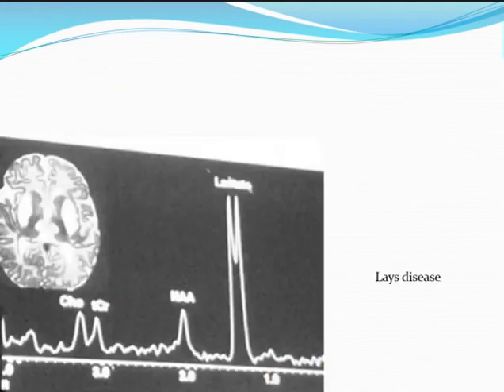This image was adopted from when I was at Zurich University Hospital. They showed us this image. It's low quality because this MR spectroscopy was done in the late 80s. While we are still looking at how to do it well, in the 80s they were already doing this. It's not a new technique; it's relatively old now. Leigh's disease shows marked increased lactate and decreased NAA with small choline and creatine peaks. Forgive me, but it's a very old image.